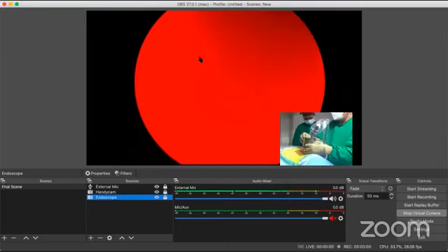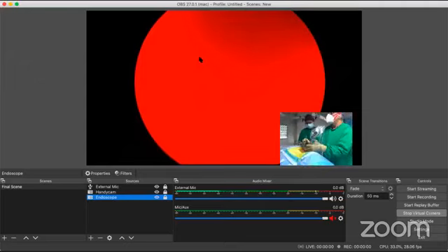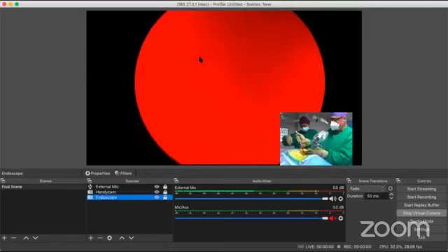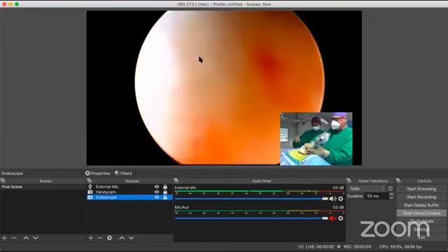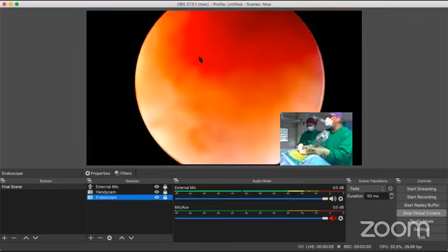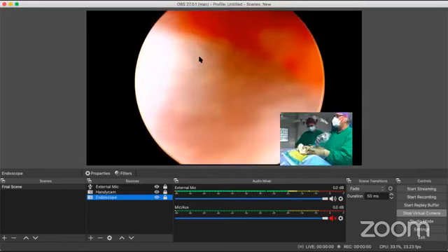That's okay, no issues. Now we're going to start the water pump, and we are going to come out with our tube of dilators. As I come out with my tube of dilators, you can see that the water starts flowing. Initially, there's a little bit of blood. Can I have a mop? But then the water becomes nice and clear. Whatever little bleeding is there inside, we are going to go in and have a look at it.